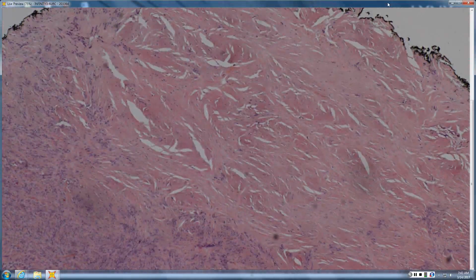in cutaneous fibromatosis. Whereas DFSPs, being a sarcoma, tend to be hypercellular across the field. So sarcomas come in two variants. Translocation sarcomas tend not to have a lot of atypia, but are very hypercellular.